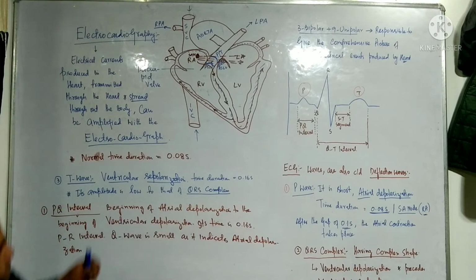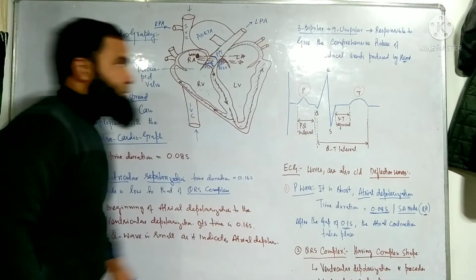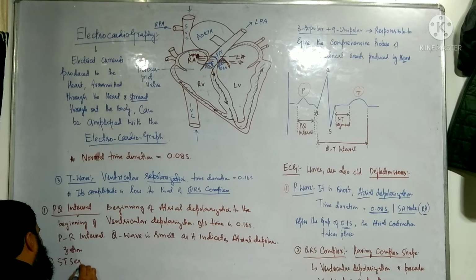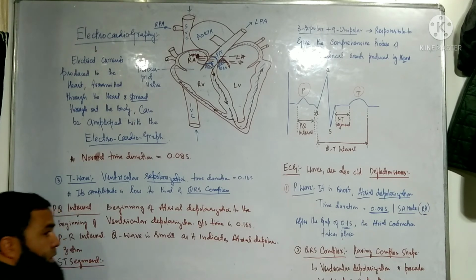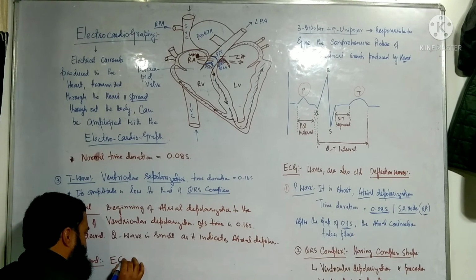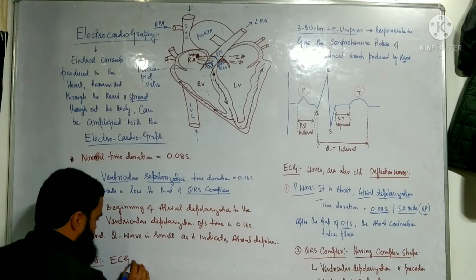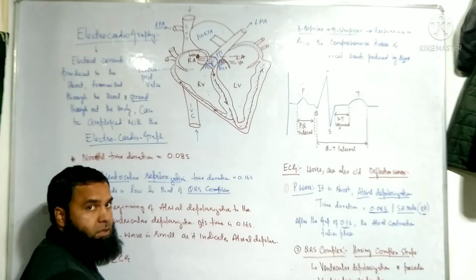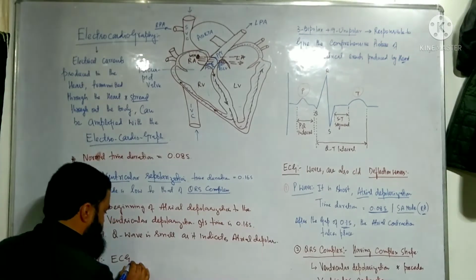Then the second point is the ST segment. We are discussing the ECG of the heart.